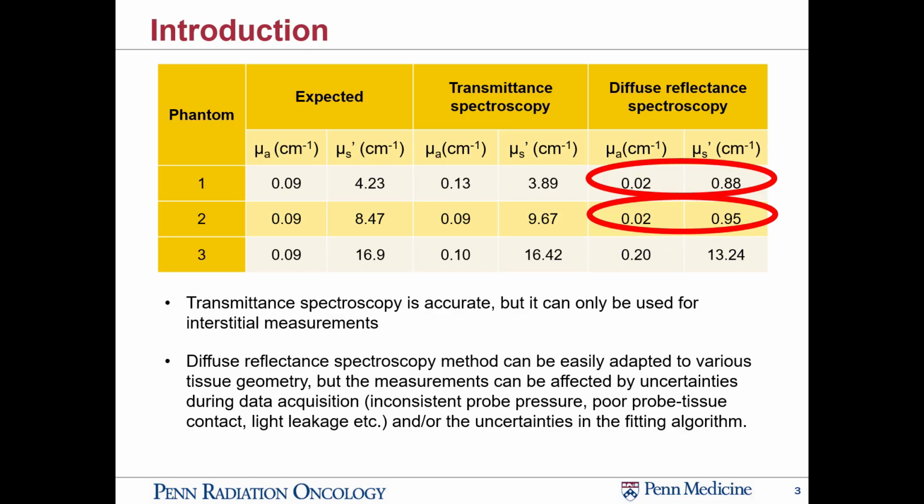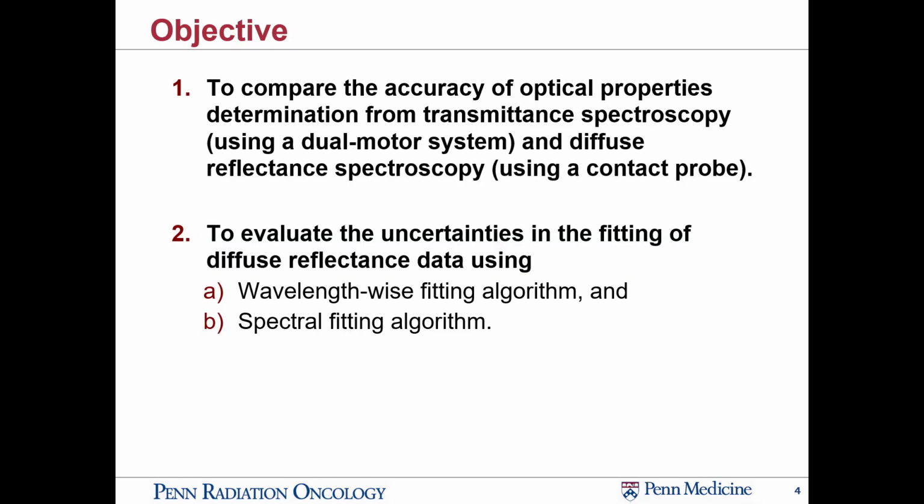be. So this is really a study to look into, is there a method to minimize this kind of large deviations of tissue optic property based on the contact probe, which has been commonly used in determining tissue optic property during PDT.